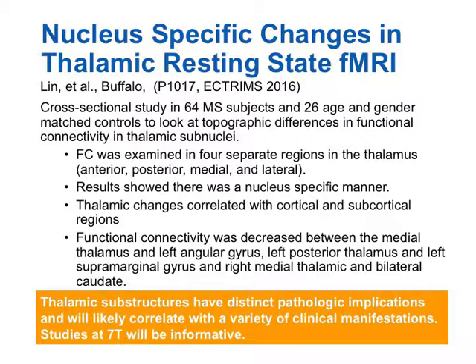So our conclusions are that thalamic substructures have distinct pathological implications and will likely correlate with a variety of clinical manifestations. And we think that the ability to look at these changes at 7T will be even more informative because the resolution, certainly in the identification of the nucleus, will be much easier.